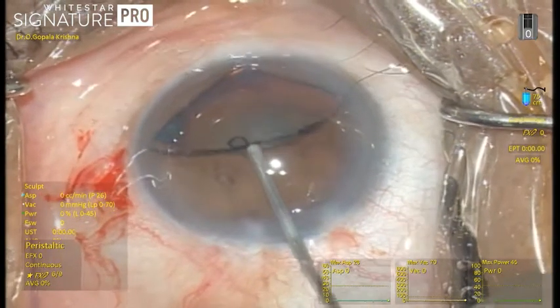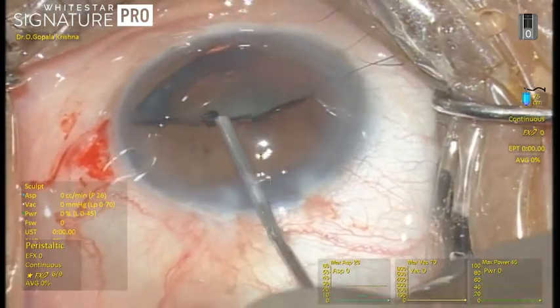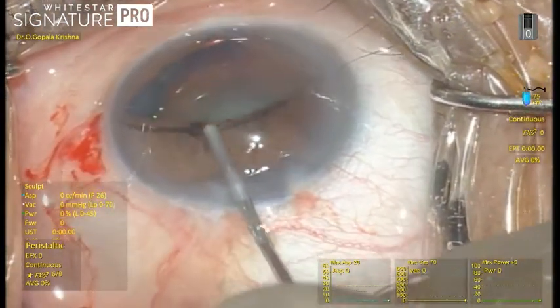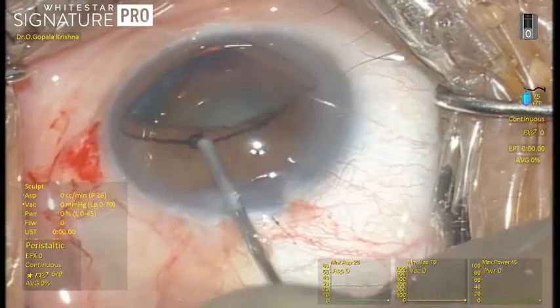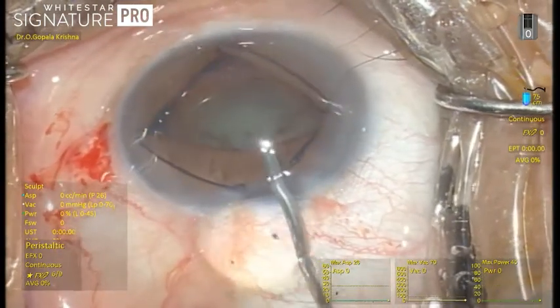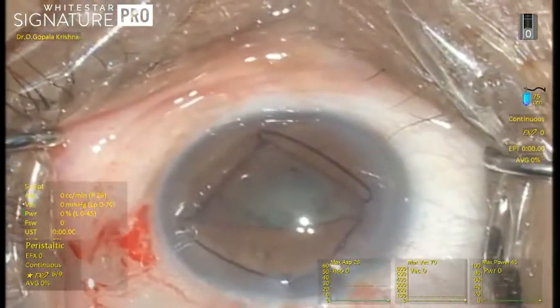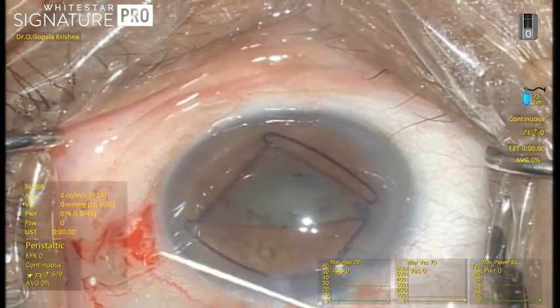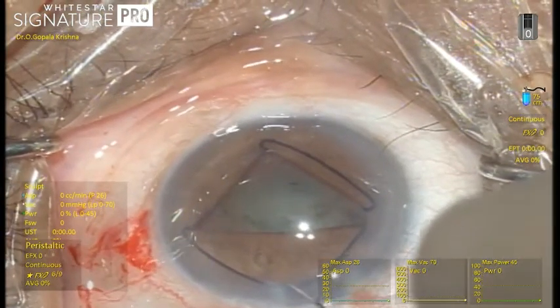With the help of a Sinski hook or a dialer, we can place the trailing edge under the pupil. Once implanted, you can proceed with your phacoemulsification. After the surgery, removal is very easy — simply take a Sinski hook or a dialer.